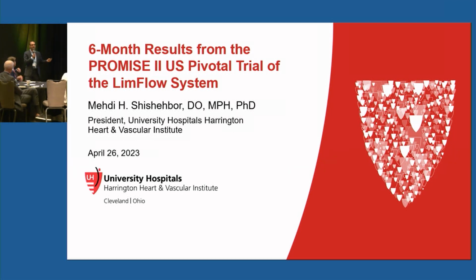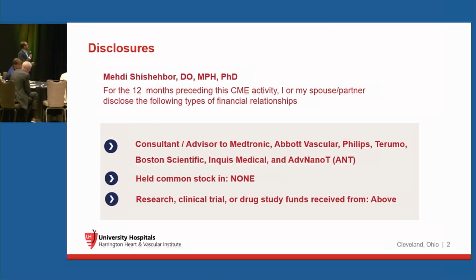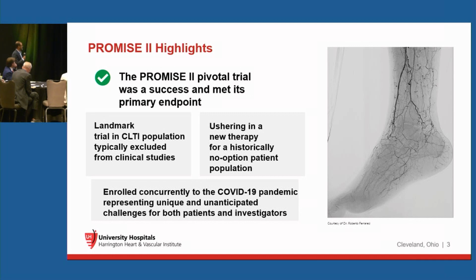But I felt it was important to understand the data first because it's a new technology, and before going to technique, let's understand how do we get to the point that we think that this may be a good idea for select patients. So this was, and this is my consulting stuff, you can see it on the website. Bottom line is that this was the summary of the data.